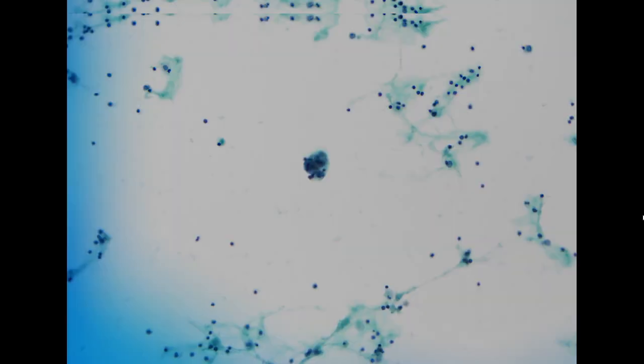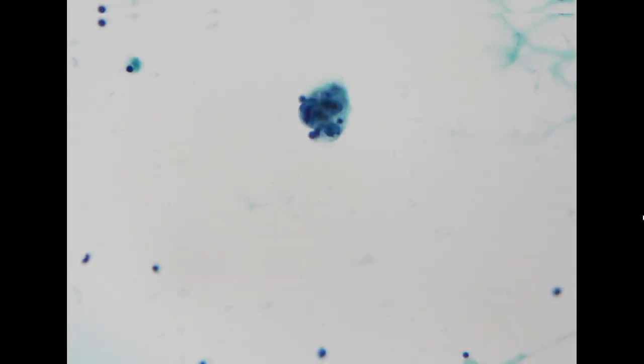It is also very uncommon to see prostate cancer go to the body cavity. So just by the cytomorphology, we think this is more likely to be of pancreatic origin. So this is positive for adenocarcinoma, likely coming from the pancreas.